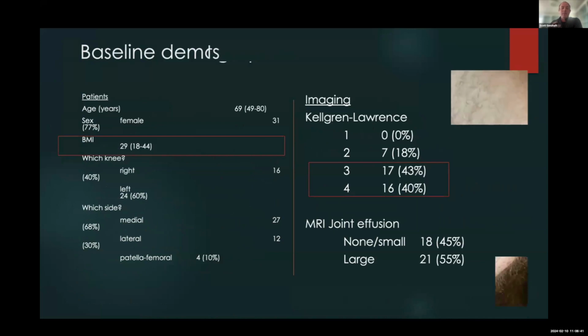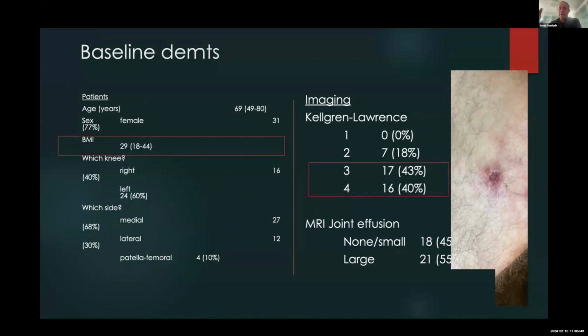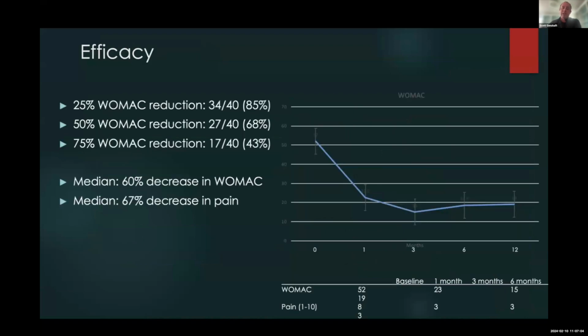And what we saw is we had very few complications. Often these patients will get a little bit of discoloration of the skin overlying the area we've treated due to a little non-target embolization. We put a cool pack on the skin in the area we're treating before we actually treat, so that we vasoconstrict those blood vessels so that they don't actually see these particles. That's been very helpful. We don't get any ulcers anymore, at least it's been a very long time. When we did get ulcers, they were very small and resolved in a couple of weeks.